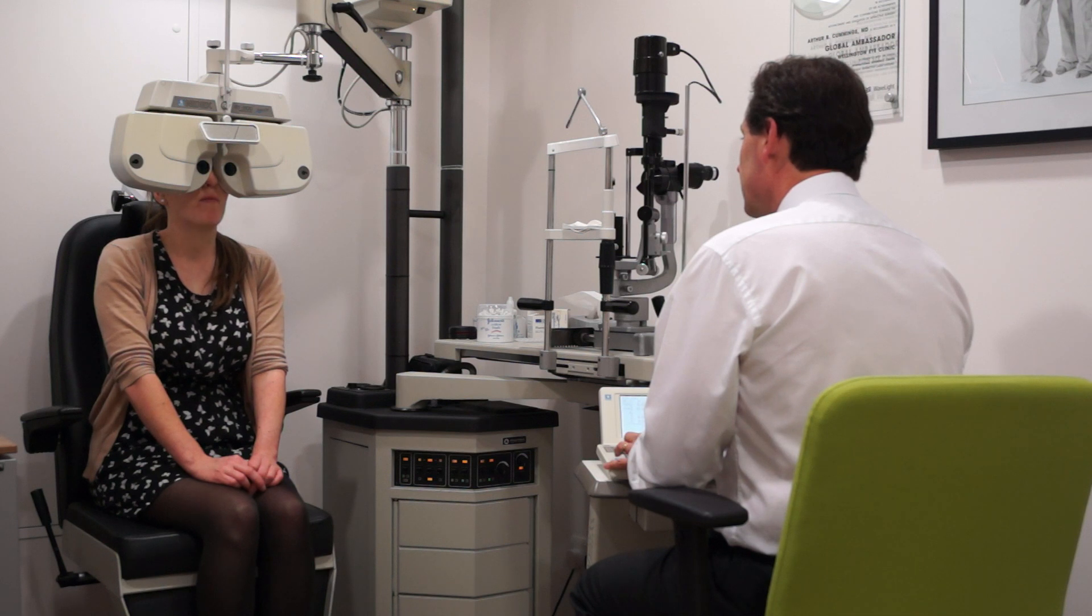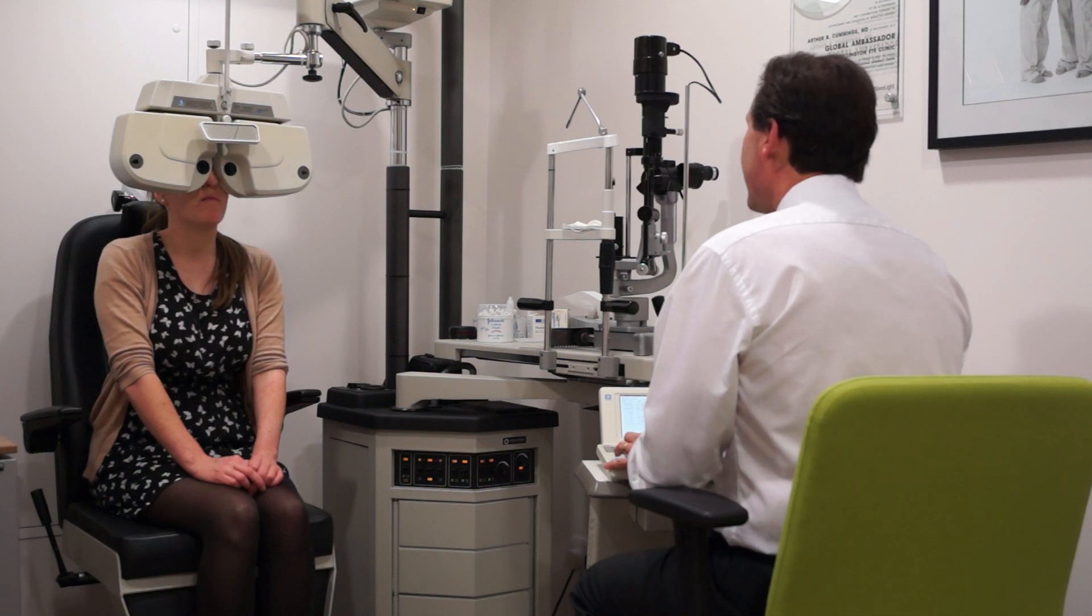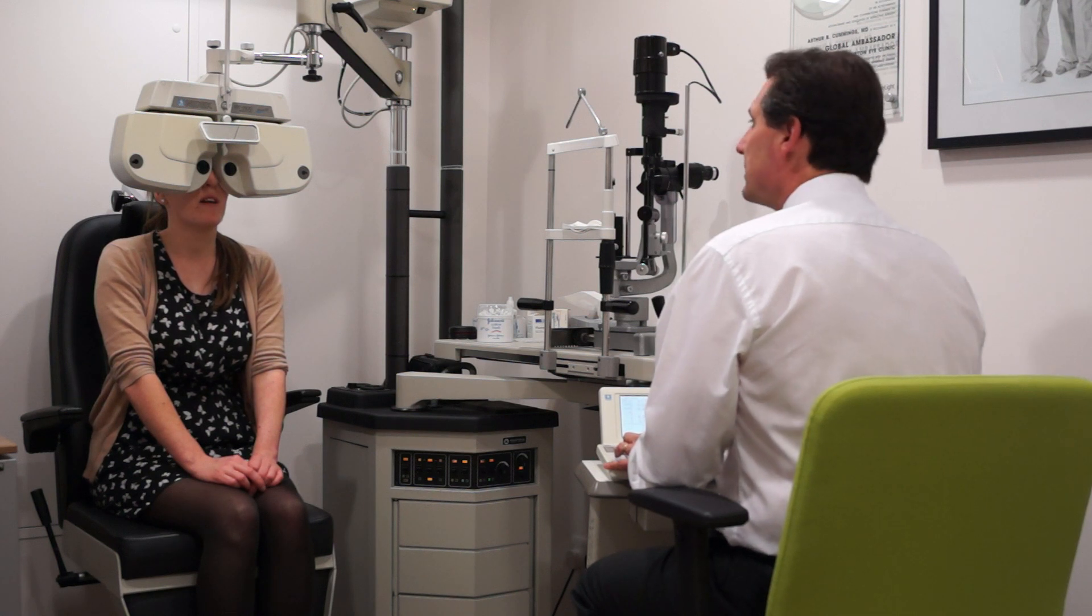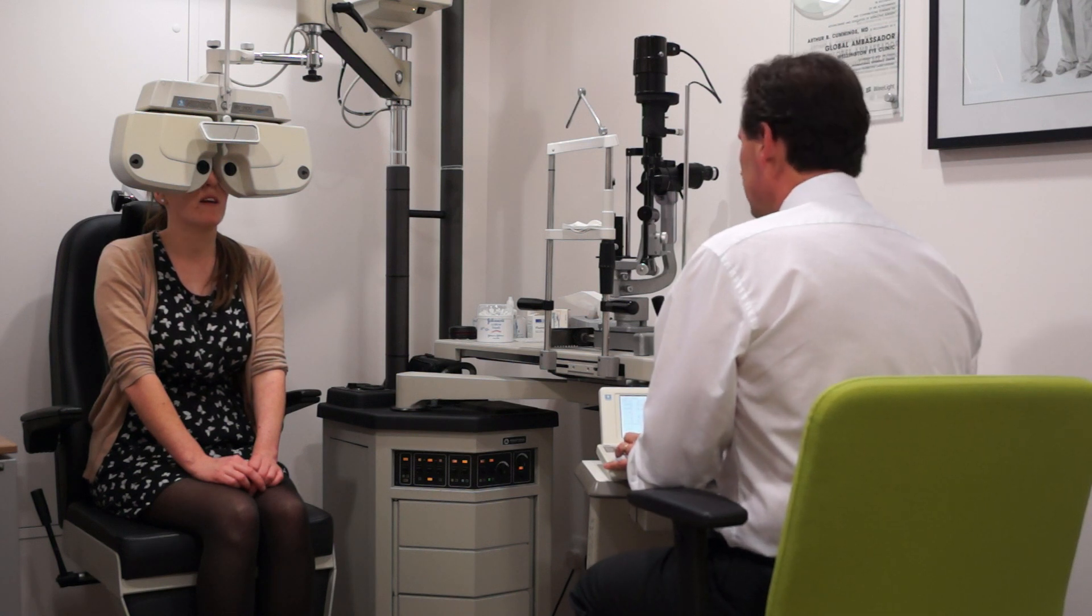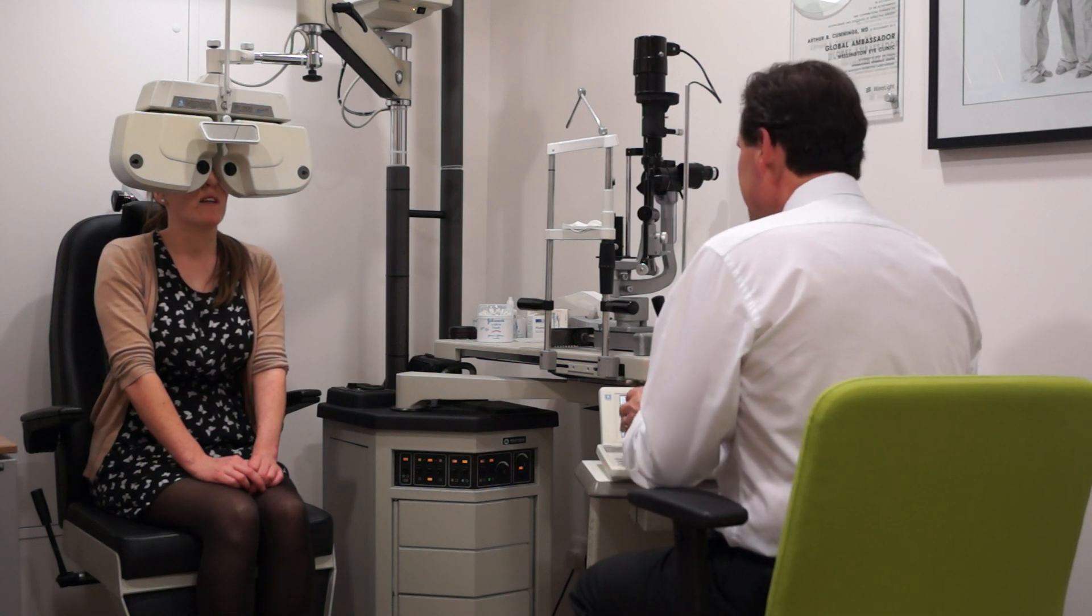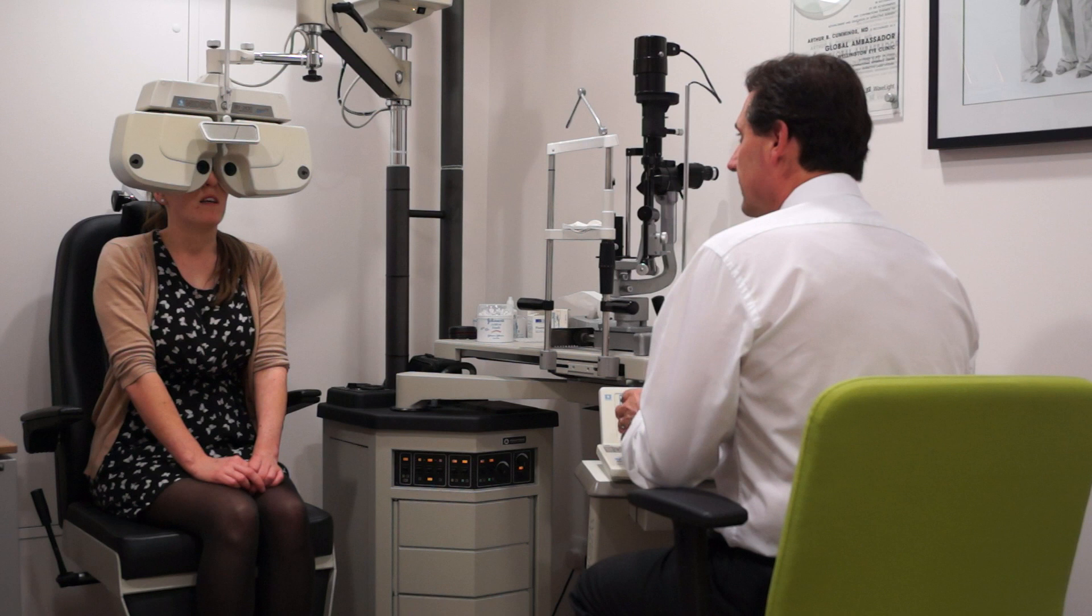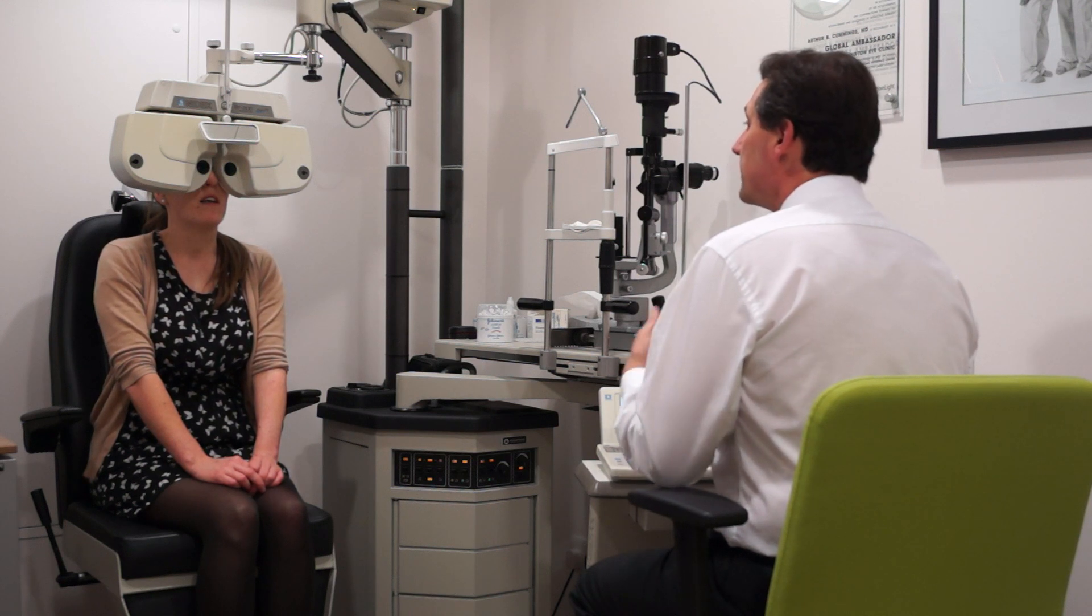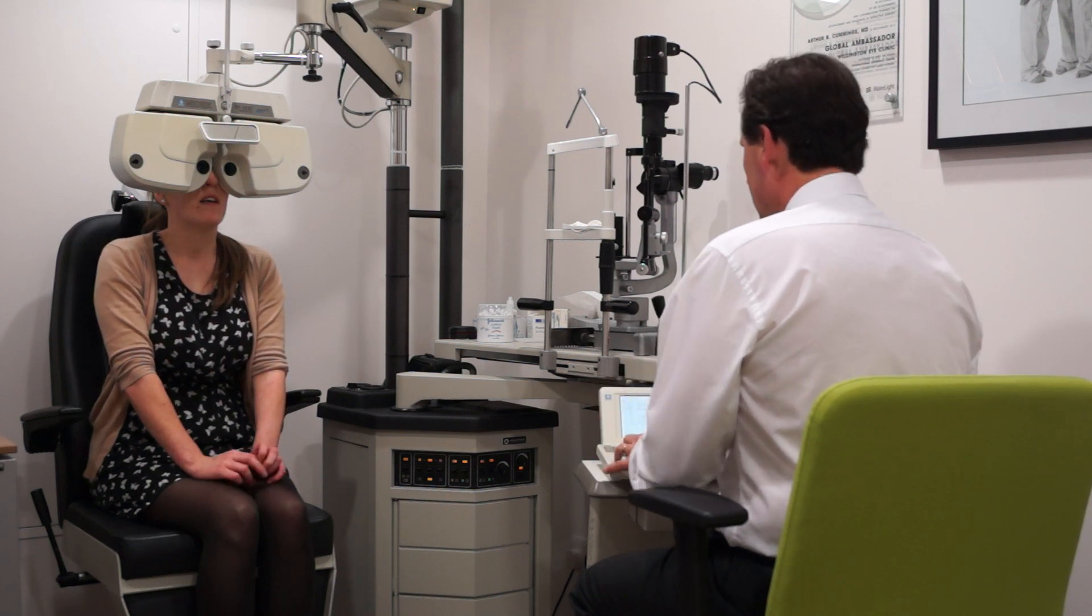One and a half. You still got 3D? It's kind of going now. Absolutely. And you have full monovision and now it's gone. Yeah. And that's why for you, this is just a step too far.